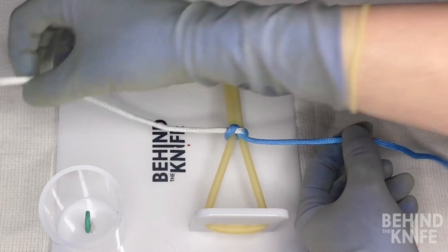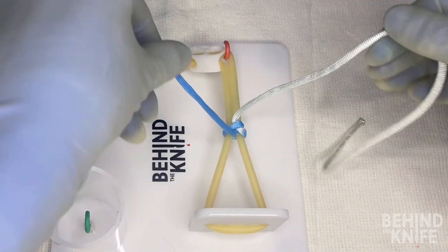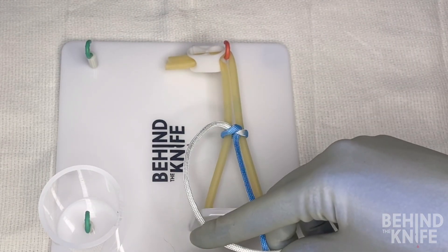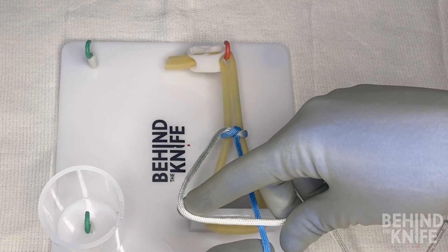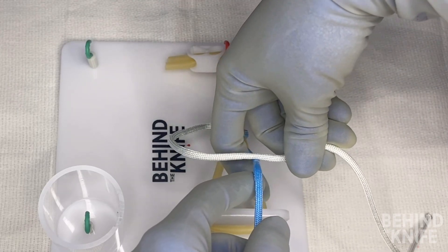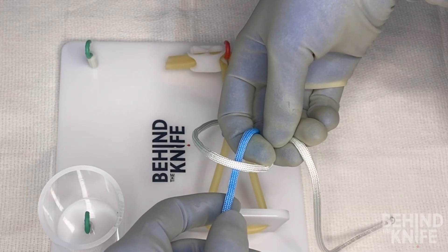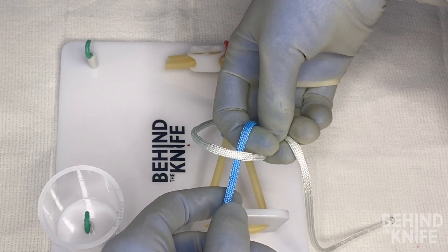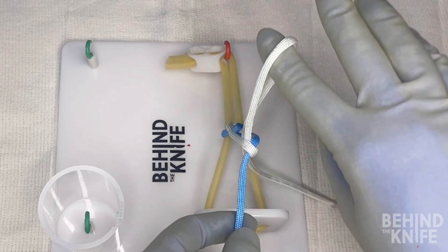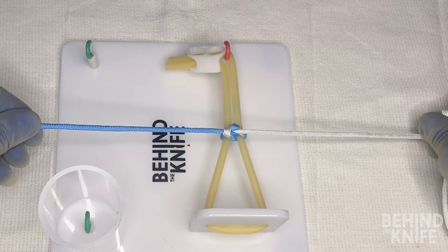To start, you'll pick up the same side of the string with the same hands as before. Using my index finger, I'm going to bring the white side of my string over top the blue side to make what almost looks like a number four. From here, I'm going to bring my index finger under the blue string and hook the side of the white string that is on the opposite side of the blue string. Then I'll take that hooked part of my white string and pull it through the middle with my index finger, and pull on both sides to bring down my second knot.